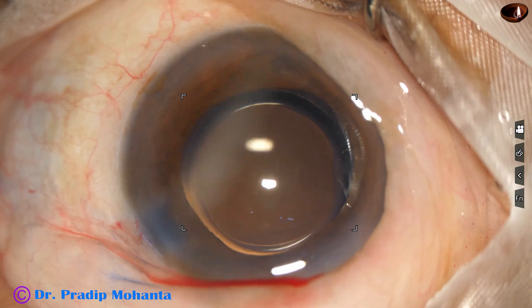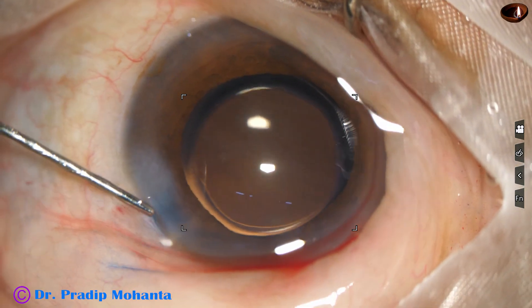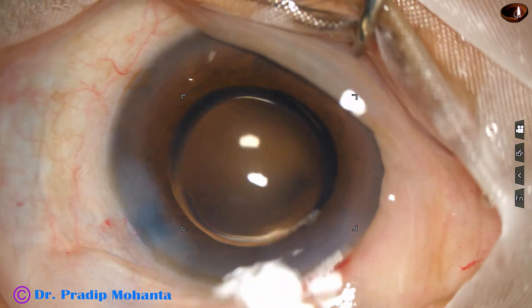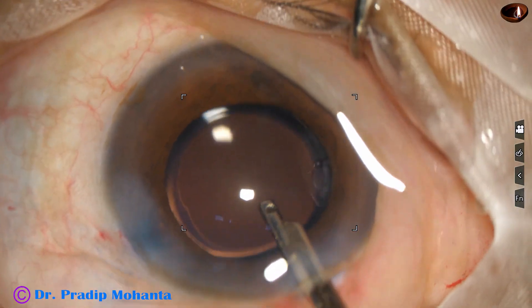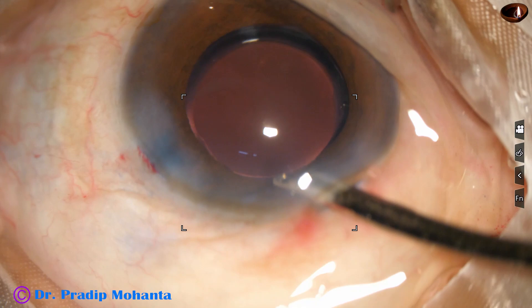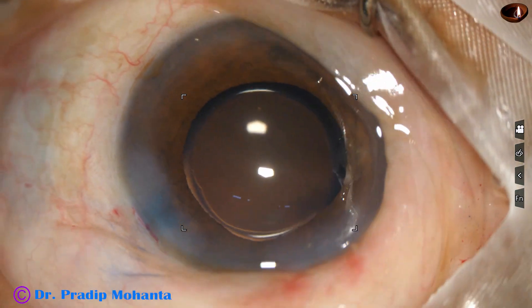This is a bit of Moxifloxacin. Then the side port is closed by hydrating the corneal stroma. The main wound doesn't require any hydration in most of my cases. This is the final formation of the anterior chamber, and then the integrity of the wound is checked and the case is concluded.